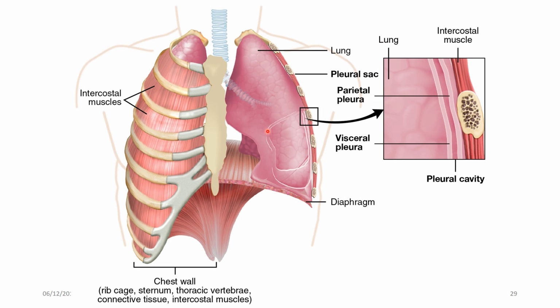So now we're going to move on to why we do chest x-rays. Now this is in relation to something that can commonly occur. We quite commonly do them for pneumothorax. This is related to trauma.